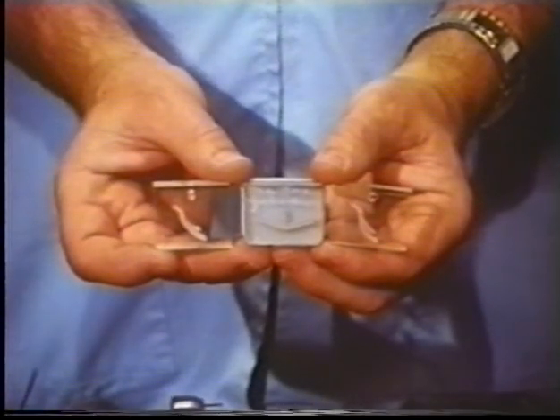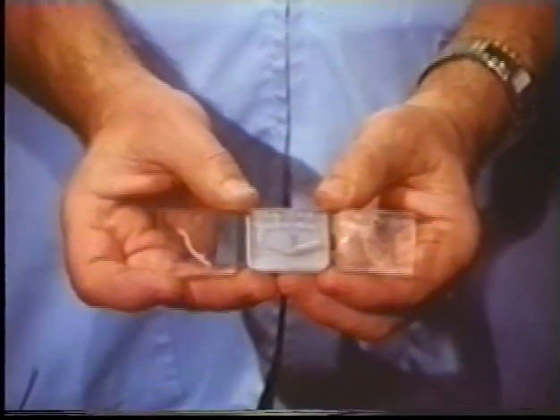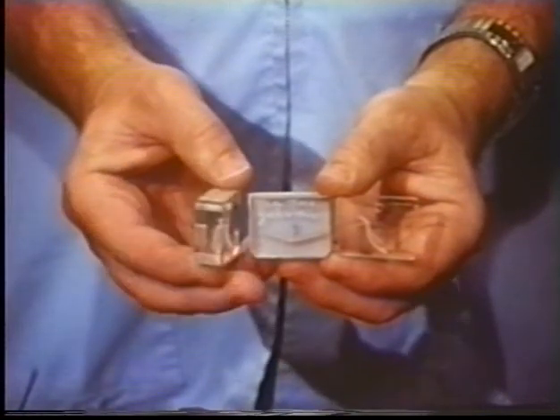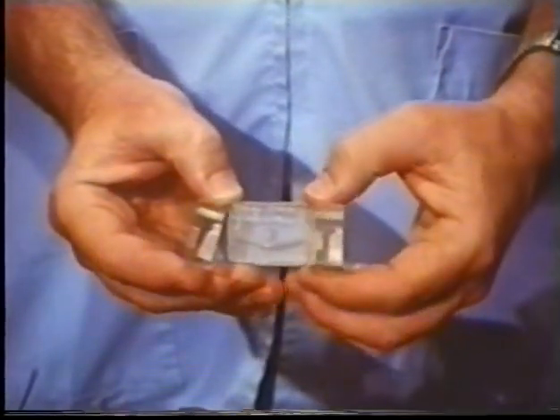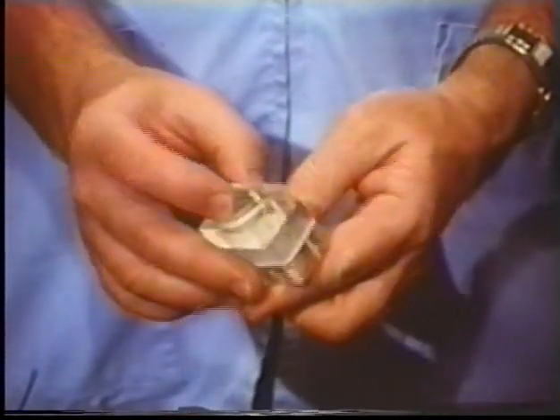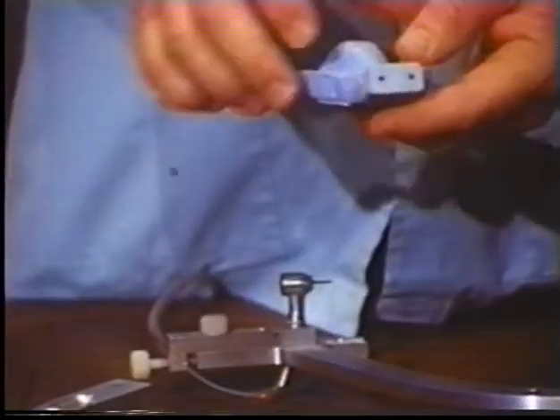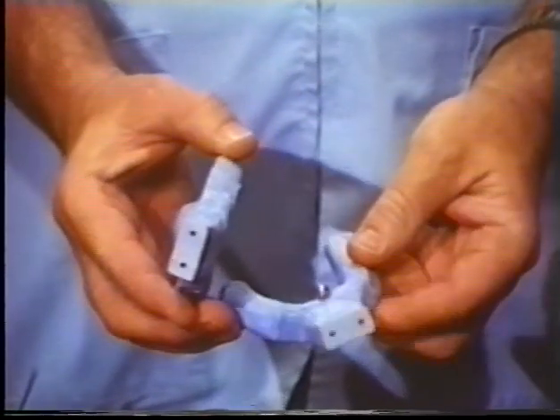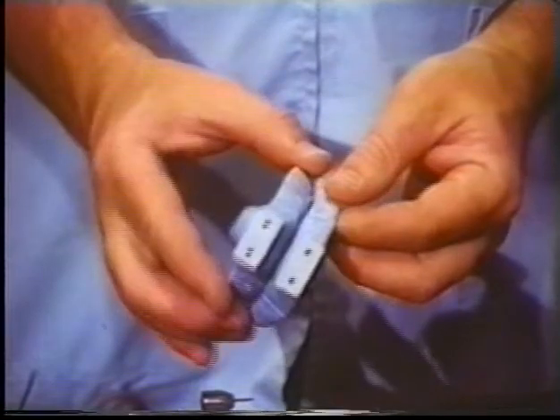Jaw movement characteristics differ from one individual to another and thus provide a very interesting subject for scientific study. This motion picture presents a new method of measuring and recording these movements by engraving them in clear resin blocks. The recording is performed with a specially designed experimental pantograph, which culminated 6 years of research effort. In order to attach the device to the patient's jaws, a set of custom-made plastic clutches are used.